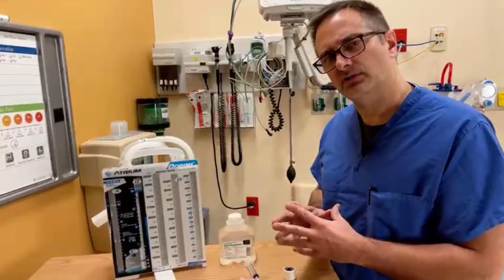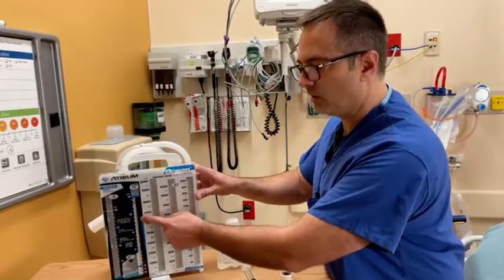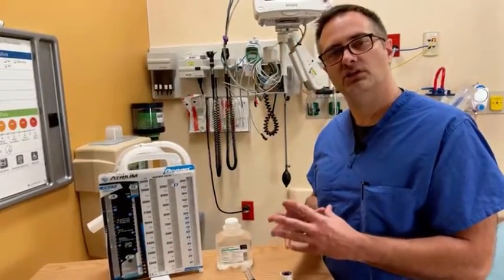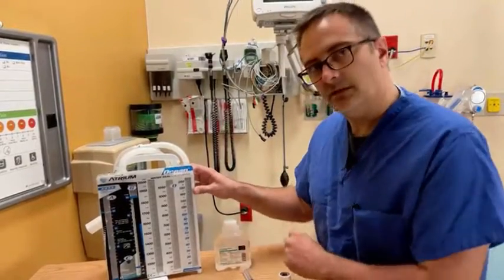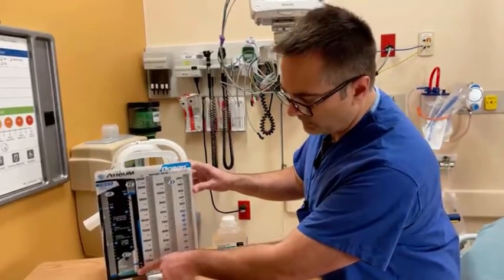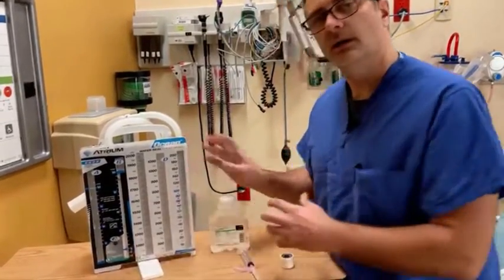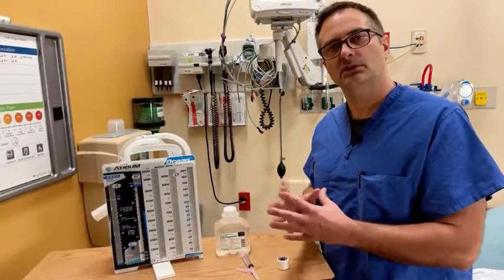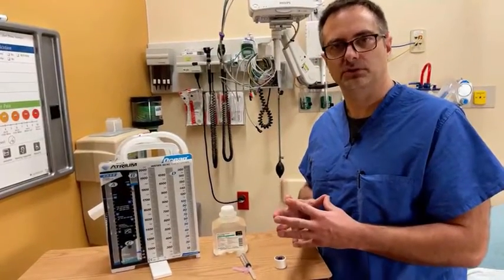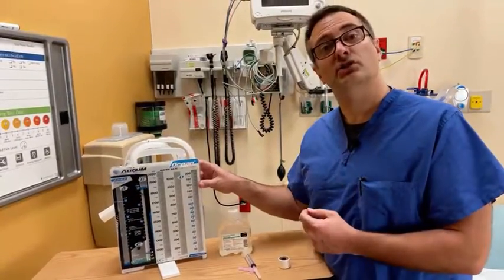A couple other functions of the water seal chamber: there's a float ball on the bottom in here, and when the patient has normal respirations, you may see this rise and fall. That's just showing the changes in intrathoracic pressure as the patient breathes. And lastly, the water seal chamber can also tell us if the patient has an air leak. Down below here we have these numbers 1 through 5, 1 being a slight leak and 5 being severe. If there's a lot of bubbling, whether intermittent or continuous, it may indicate a leak and we need to troubleshoot the system.